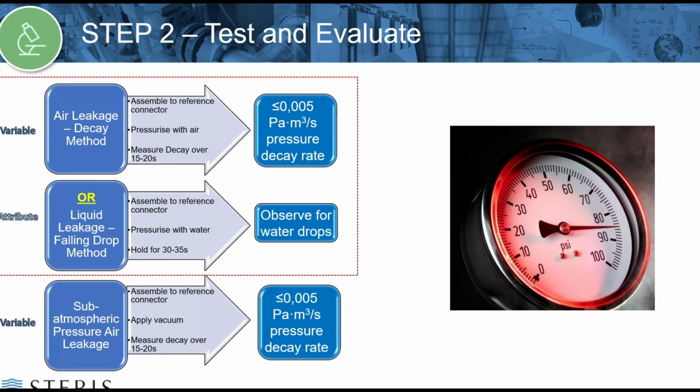So the first test on the sequence, and actually before I start into each test, it's important to note that we recommend that fresh samples are provided for each test method. So we have 6 test methods here, and if your sample size is 29, we recommend 6 by 29 samples are used to perform the testing. Stacking of testing is not required by the standard, and it does not provide a true representation of the test requirements.